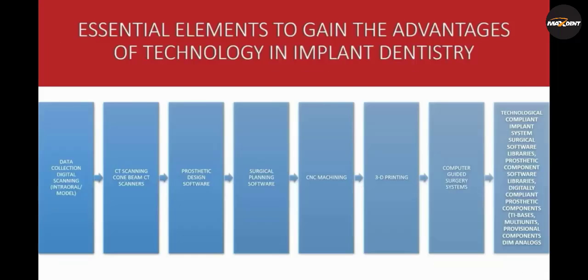Let's review some of the essential elements to gain the advantages of technology in implant dentistry. Surface scan with the intraoral scanner or optical scanner. Cone beam scan. Prosthetic design software. Surgical planning software.